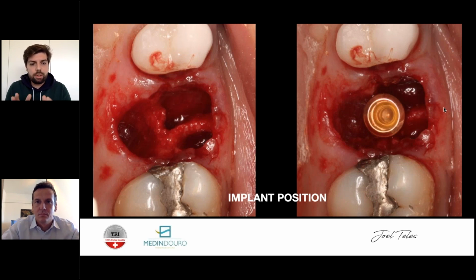Okay, so there's no easy answer for that. But I will take as long as necessary because the rest of the surgery depends on that very moment you extract the root, and now you keep everything after the extraction. So I'll take my time. Okay, so normally I prefer to use wide implants in these situations if the bone that's left in between the roots gives me comfort enough to place the implant and have the feeling that it's going to the right place and I have enough big bone implant contact.